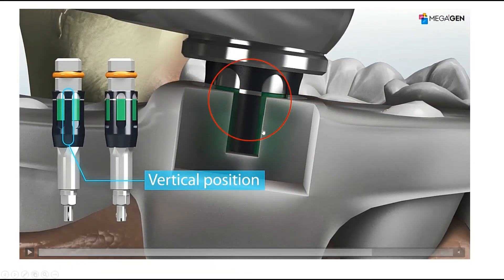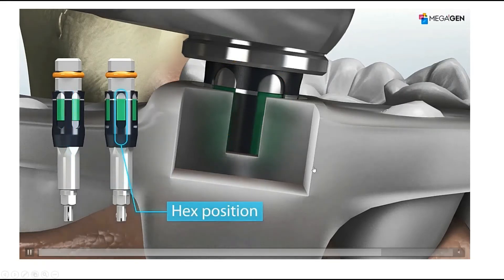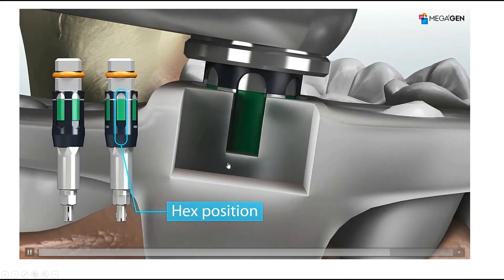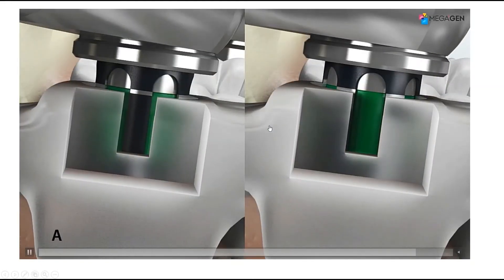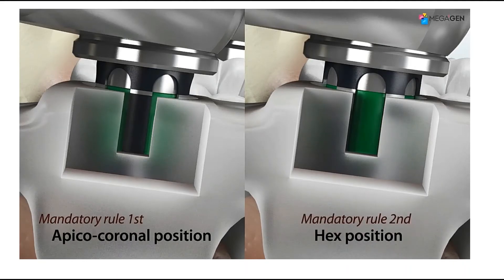But what about the hex position of the implant? Is this the correct hex position that I planned for? No. In order to place the implant in the same hex position that I planned for, I can just torque the implant down a little bit more until the green shows through the built-in window in the surgical guide. Right now I have applied both rules — the apico-coronal position, the depth of the implant, and the hex position as well. This is how you place the implant with the most accuracy, exactly as you planned.